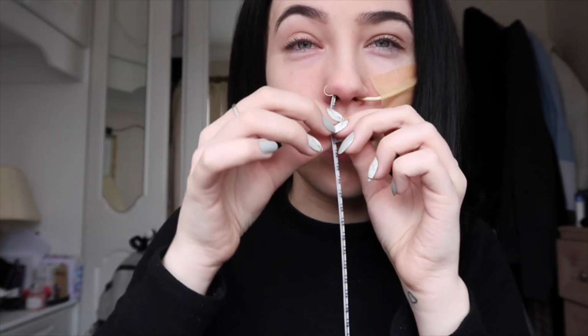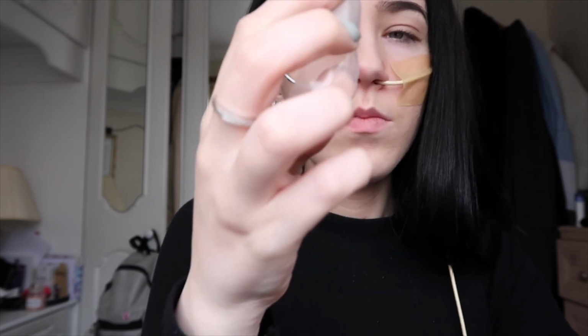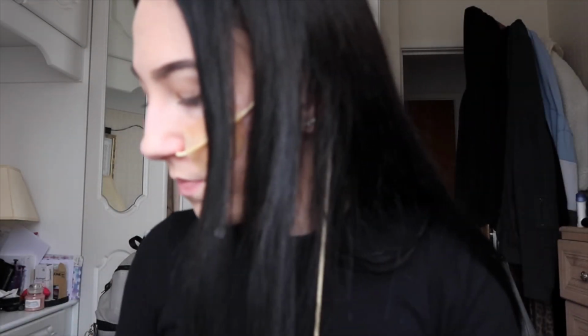I'm going to rip this tape off now, and I'm going to just put it behind my ear for a second. And I'm just going to tape it in place. Make sure you tape it before you start trying to draw back anything, because otherwise it might move. So we're going to tape, might be a bit too much tape, but that's alright.